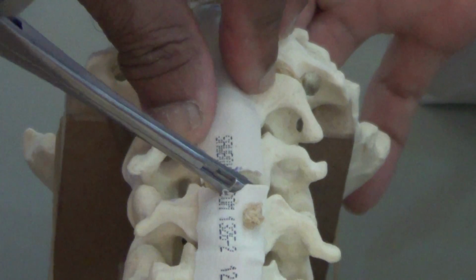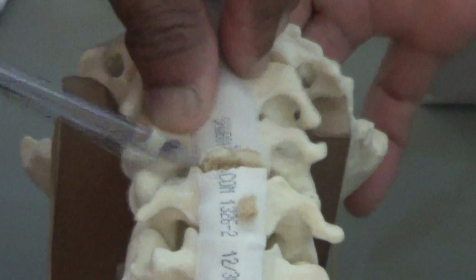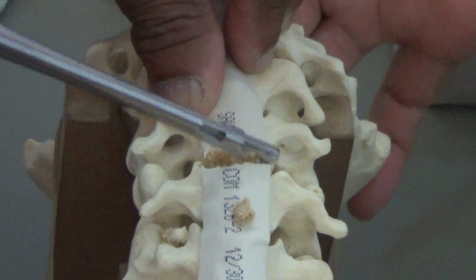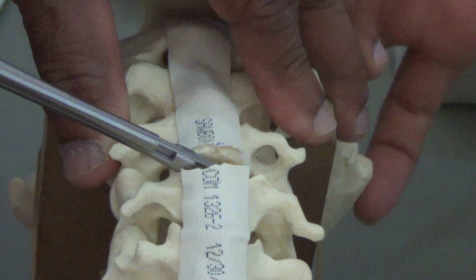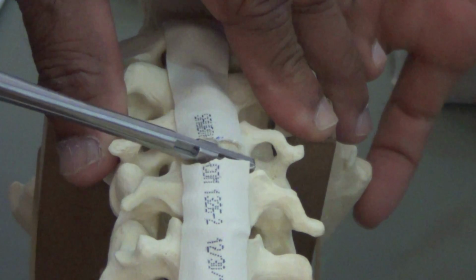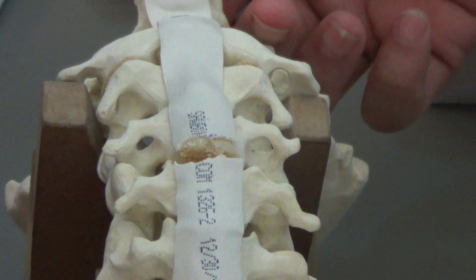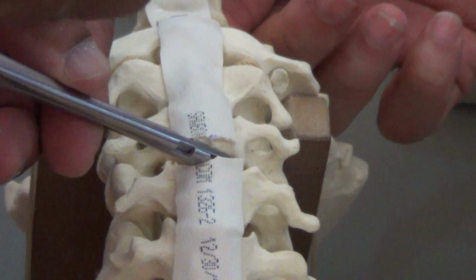Now it's important you take out the disc. You remember your distraction is also there. And then till how much do you take out the disc? Till you see the posterior longitudinal ligament. Now, once you have seen the posterior longitudinal ligament, then it is important from the MRIs to see where the disc is prolapsed. It is usually prolapsed on the lateral side. I usually take out the posterior longitudinal ligament. How do you take out the posterior longitudinal ligament? You can use a 1 mm Kerrison rongeur, and slowly you can take out the posterior longitudinal ligament.